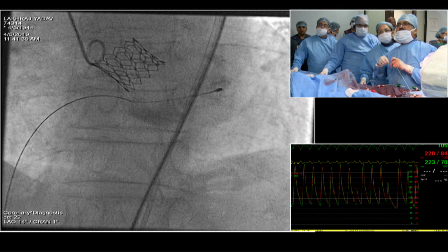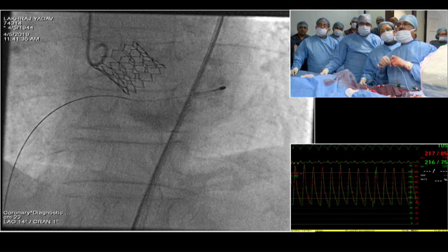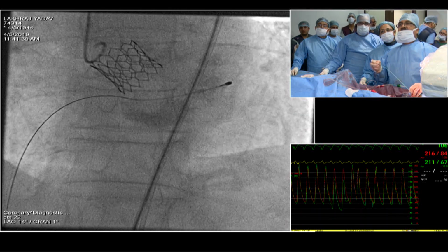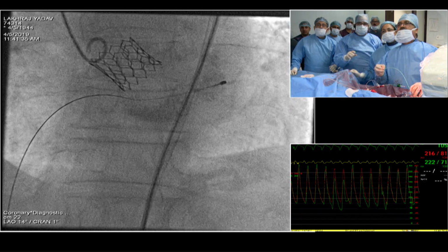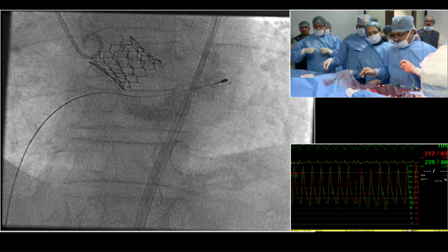Dr. Ramesh and others, actually, when the patients are so low, can you stabilize the patient a little with noradrenaline and then decide? Yes, that is what we did. But the aortic regurgitation was severe. I think you could have taken some time to stabilize the patient then. Yeah, let us guide with the echo rather than doing angio at this stage.